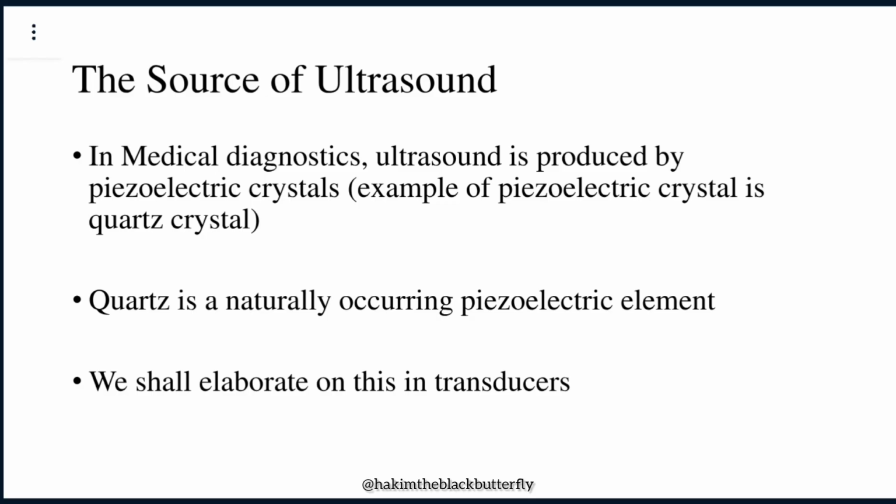In medical diagnostics, ultrasound is produced by what we call the piezoelectric crystals. An example of a piezoelectric crystal is a quartz crystal. I know all of you have seen this word quartz because you have all put on watches before where we have the word quartz. Quartz is not a manufacturer of watches, as most people think. Quartz is a crystal in your watch.